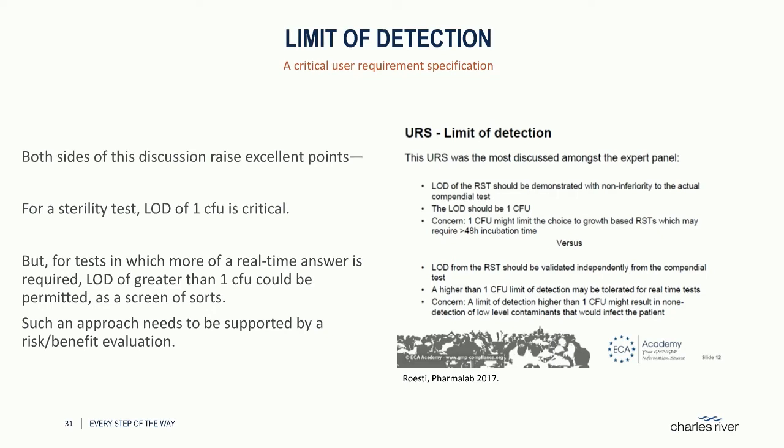I would maybe consider this something like a screen. Of course, maybe it doesn't meet the definition of a traditional sterility test, but that doesn't mean that it would be without value to do such a test. Of course, because there's some kind of compromise here, and overall patient welfare needs to be considered, an approach like this, with maybe a screen, would need to be supported by a well thought out and well explained risk and benefit evaluation.